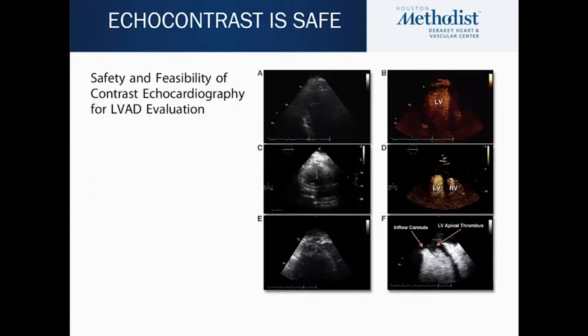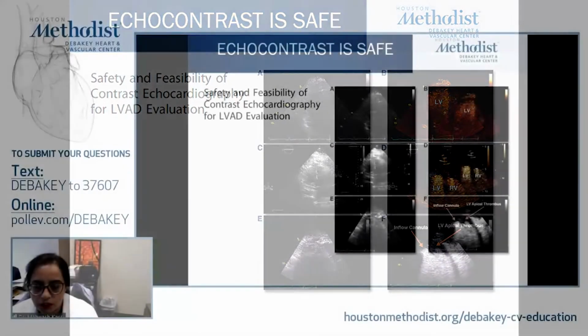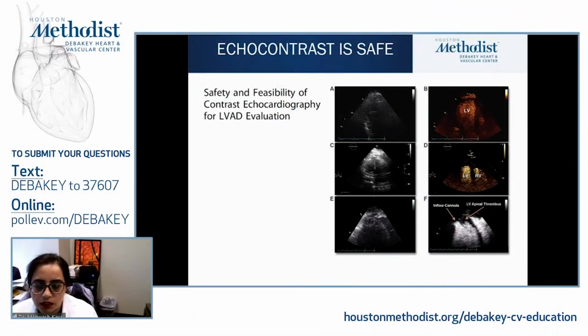Some of the time, one of the biggest challenges we have is whether we can use contrast in these patients. We've all experienced this, that LVAD imaging can sometimes be very hard, particularly because of the inflow cannula metallic artifact, and we don't see very well on imaging. This was from JACC Imaging, where they said that you can use echo contrast and it is safe and feasible to use it, particularly if the question is around understanding whether they've had recovery or if you're looking at RV function.